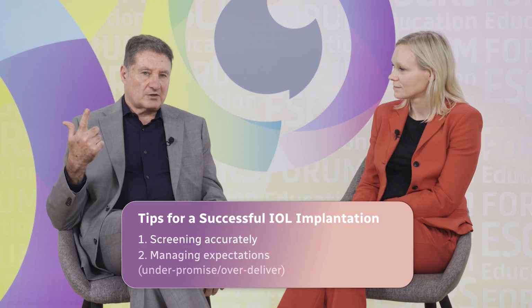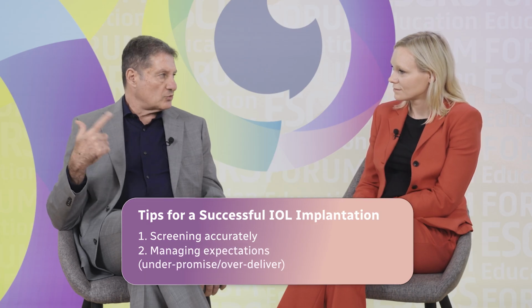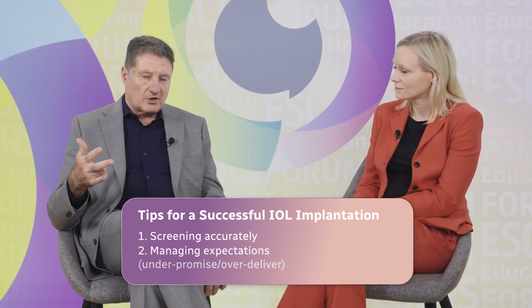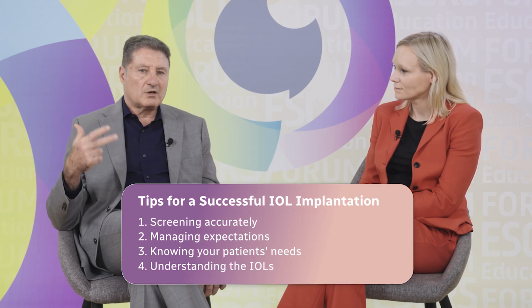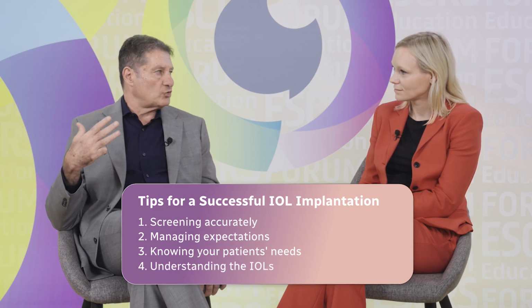What's your best advice for colleagues who want to make simultaneous vision IOLs a predictable, high satisfaction part of the patient's life? First of all, screen accurately. Yeah. Second, under-promise to over-deliver. Third, know your patient. And fourth, know the IOLs that you're going to implant.